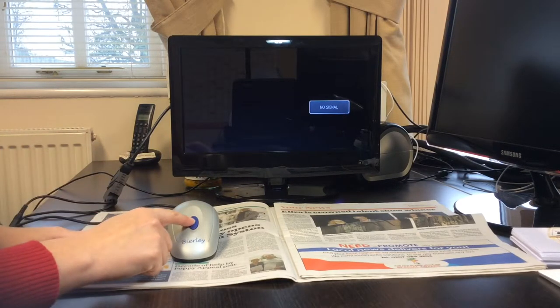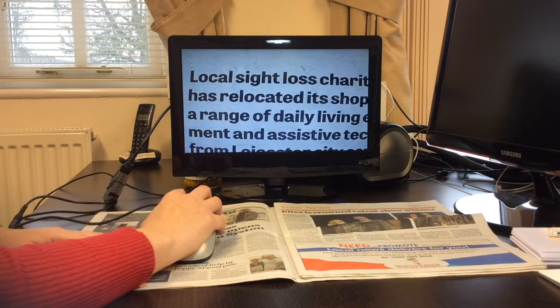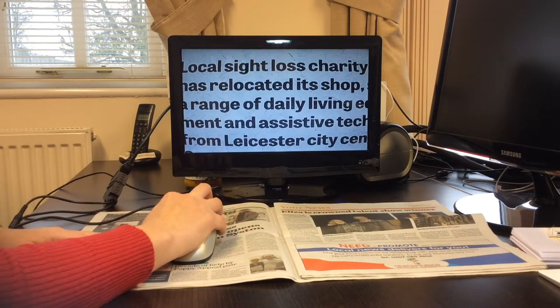Place the mouse onto any reading material and press the large button to turn the mouse on. The magnified text will be displayed on your television screen.